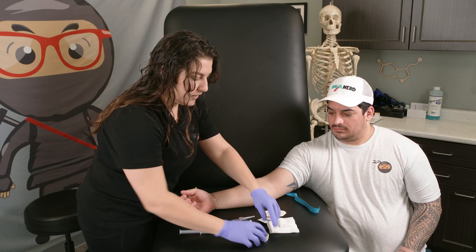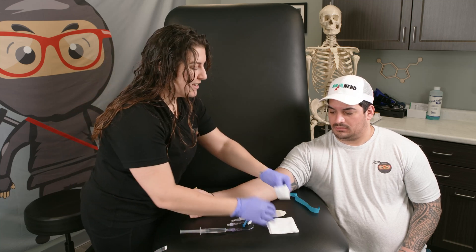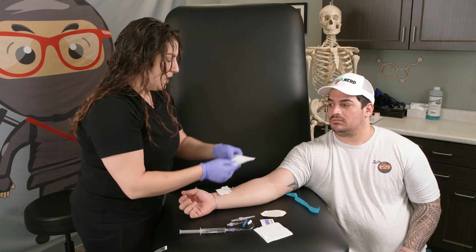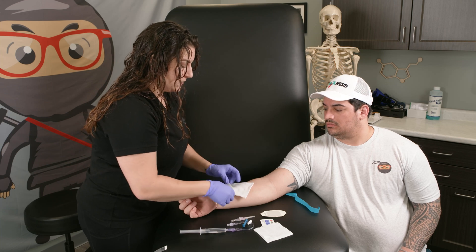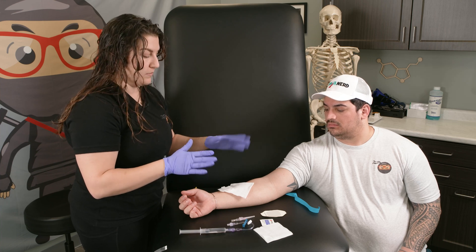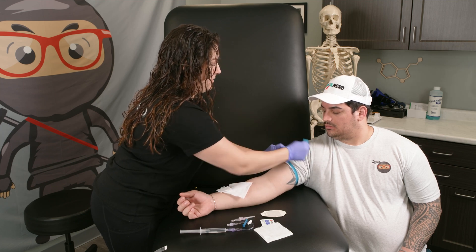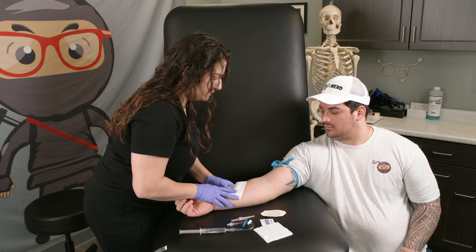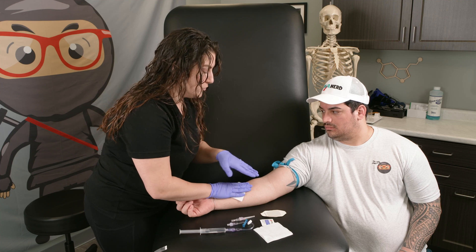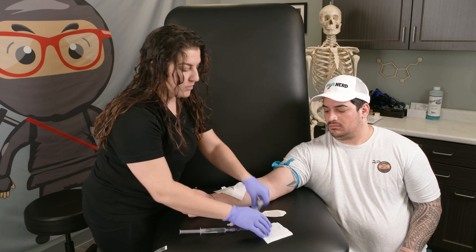I'm going to put my gloves on. I also like to get the tape ready and put it off to the side — tape can be hard to manage with gloves. I like the big 4x4 gauze; I'm an ER-trained nurse and IVs can be a little messy so I want something I can quickly grab. Now we're going to put the tourniquet back on and look at the patient's arm in the antecubital area. This is the area you want because if they need contrast dye for imaging, these veins are the best — they're plump and at the surface.